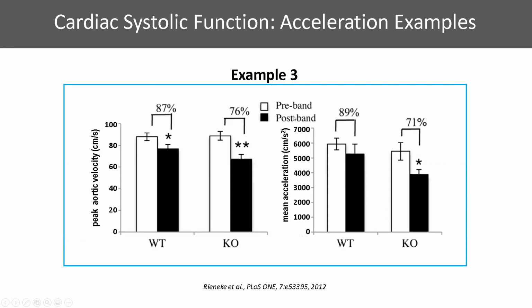And this is in TAC, aortic banding. You all would know that it's not easy to put a catheter in animals that have undergone TAC, because you're shutting off the main vessel that is absorbing all that extra pressure load. So this is a good way of doing it non-invasively and still getting the contractility type of function in these animals.